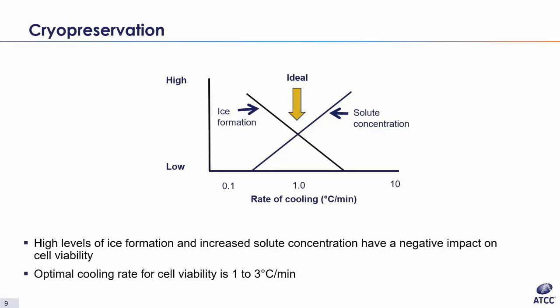In the next several slides, we want to discuss techniques on cryopreservation. I want to first go over the basic theory behind cryopreservation and how it works. So the freezing process is a complex phenomenon that's been studied for decades. Cellular metabolism stops when all water is turned to ice.